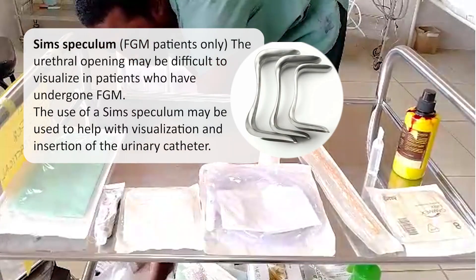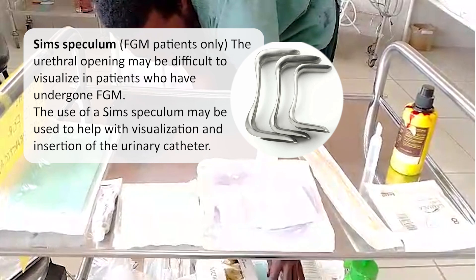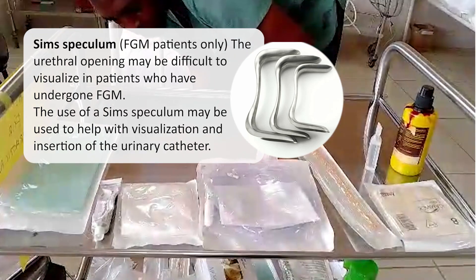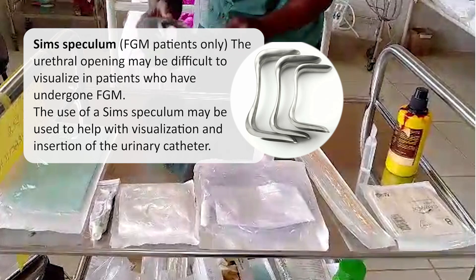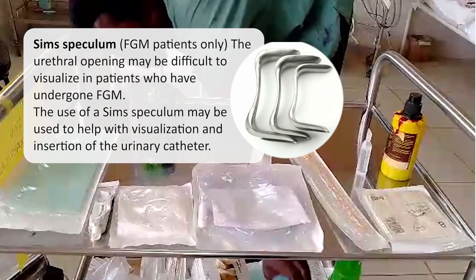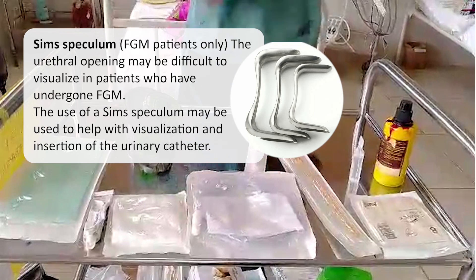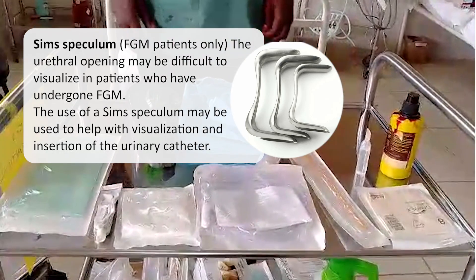A SIMS speculum may be needed if the patient has experienced female genital mutilation. The urethral opening may be difficult to visualize in patients who have undergone FGM. The use of a SIMS speculum may be used to help with visualization and insertion of the urinary catheter.